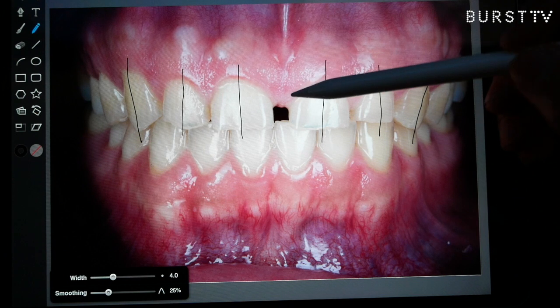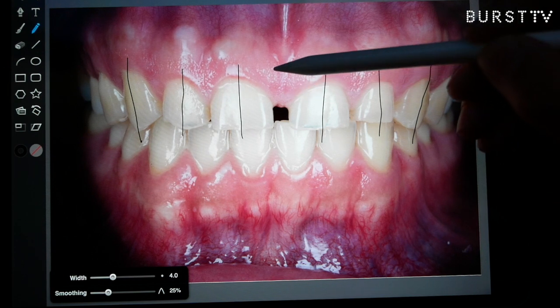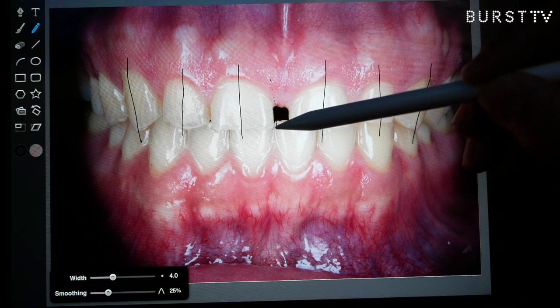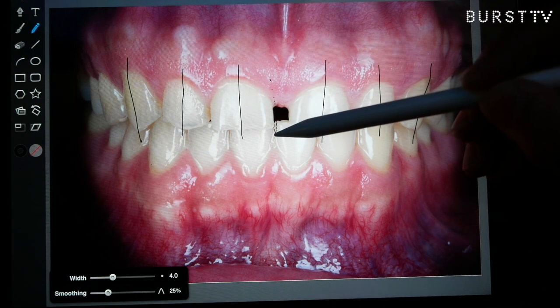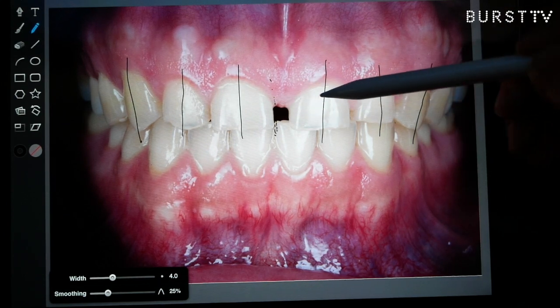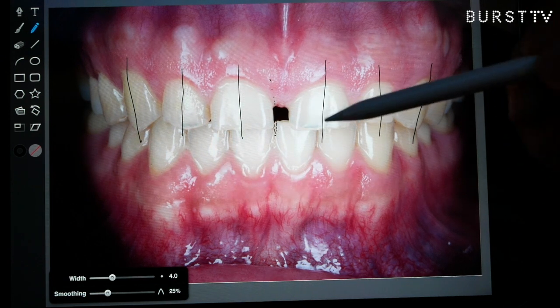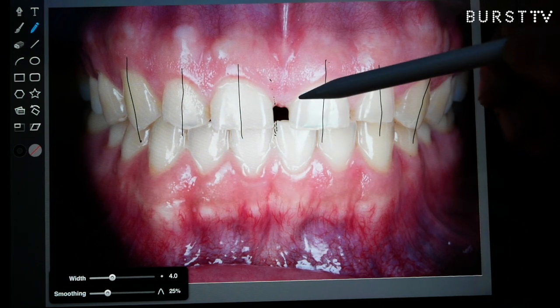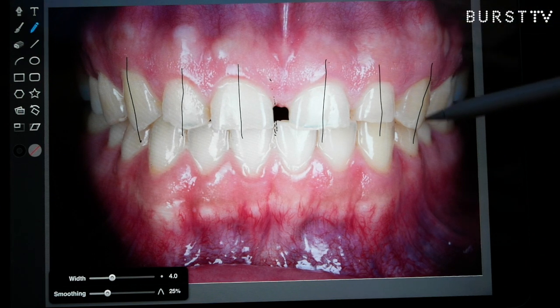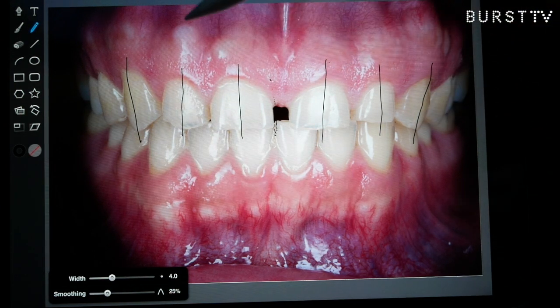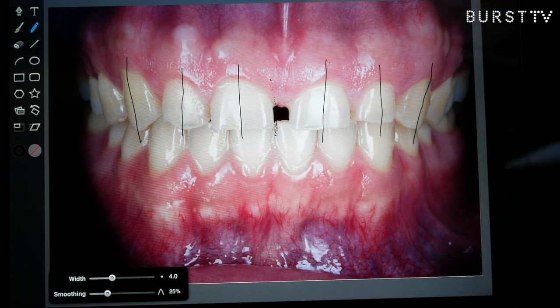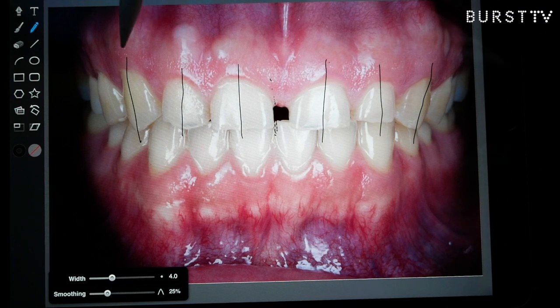Next, one thing that we notice here is this midline. It looks like this number eight — the central right here — is in line with the lower. So the question then becomes: what am I going to do with this diastema space and how am I going to close this space up? Most likely I'm going to move the patient's left side over. You can kind of tell from the angles where the teeth line up. It looks like the patient's right side is pretty good; left side needs a little bit of work.